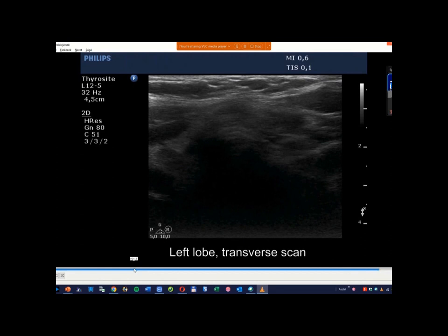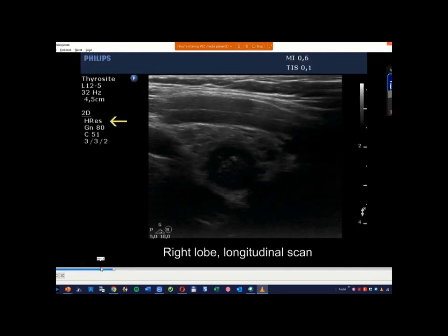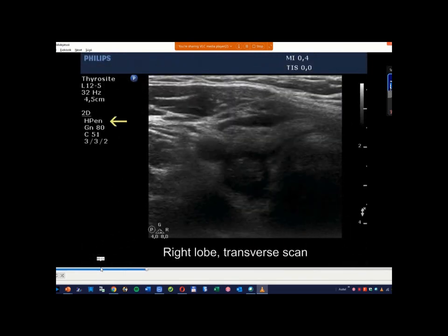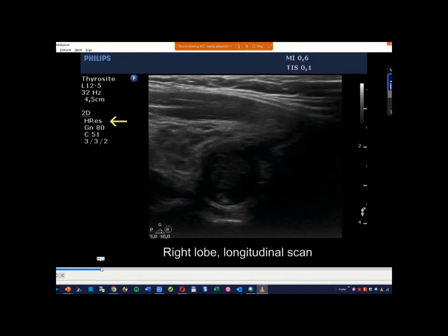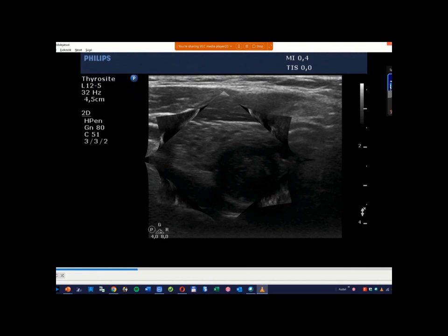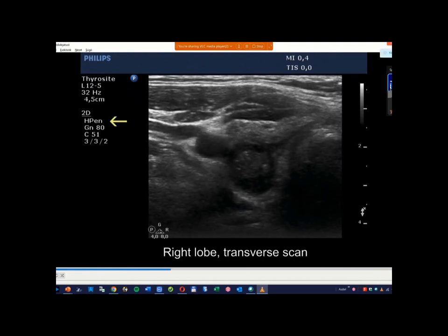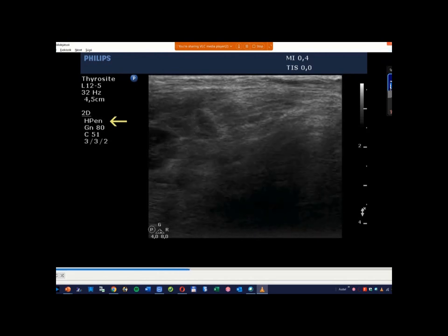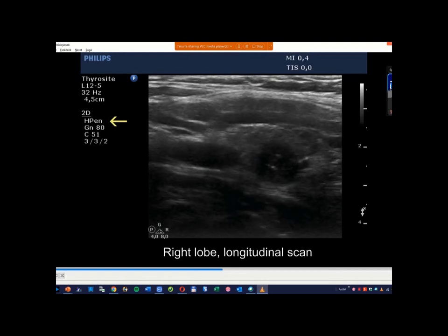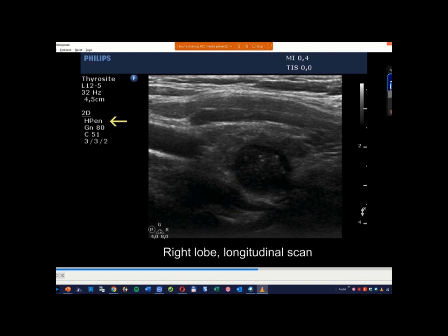Eighteen months after the first cytological examination, the nodule had grown by more than 2.5 times in volume. The second cytology again resulted in Hashimoto's thyroiditis, but together with Gábor Kovács, we decided to send this patient to surgery, and histopathology disclosed Warthin-like papillary cancer.